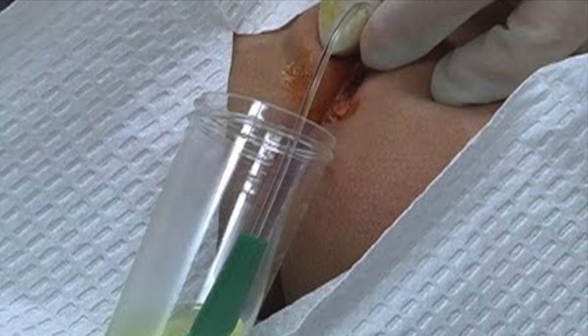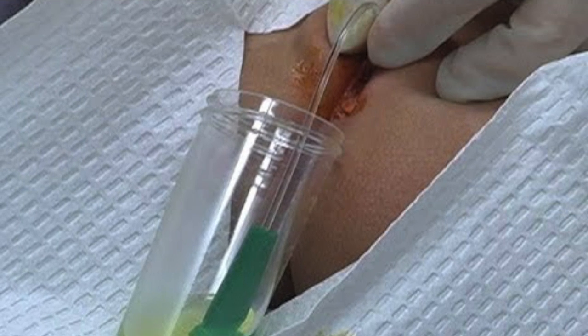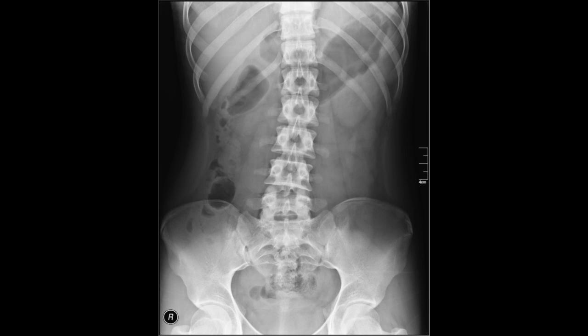After catheter placement, the bladder should be drained prior to instillation of contrast media, and a sterile urine specimen may be retained for culture if clinically indicated. If a recent abdominal image is not available, a preliminary abdominal image may be obtained and reviewed before instilling contrast media in order to detect findings that would affect the performance of the study, such as contrast in the GI tract, opaque calculi, and skeletal anomalies.